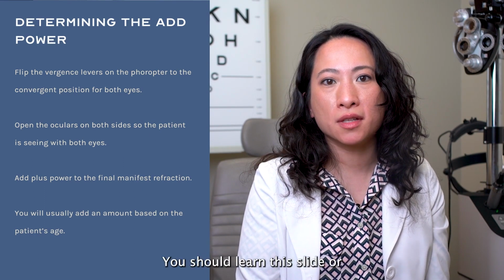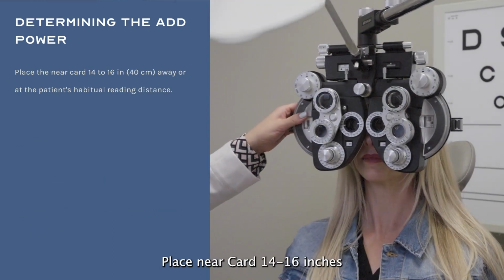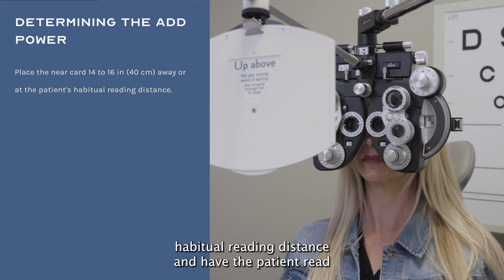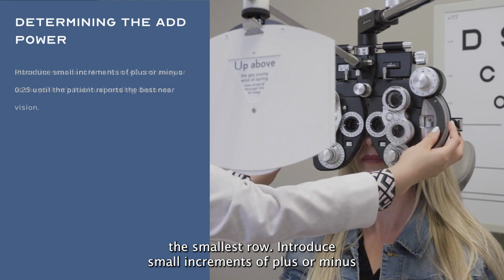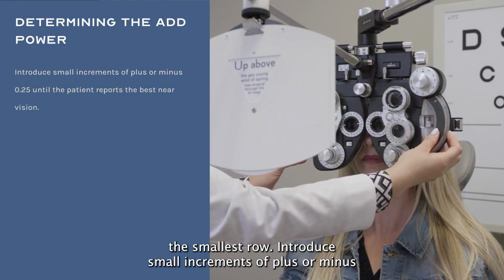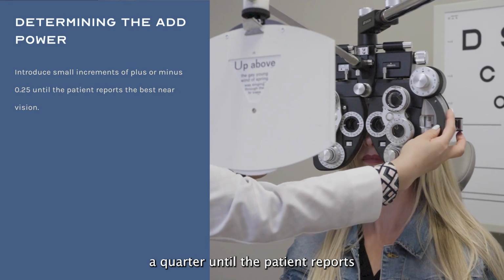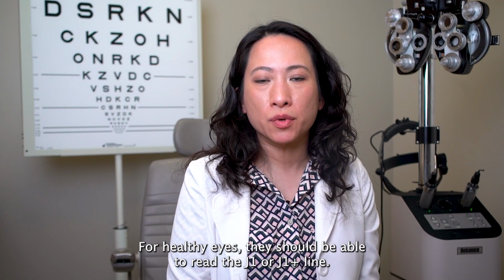You should learn this slide or keep this information somewhere handy. Place the near card 14 to 16 inches or 40 centimeters away, or at the patient's habitual reading distance, and have the patient read the smallest row. Introduce small increments of plus or minus a quarter until the patient reports best near vision. For healthy eyes, they should be able to read the J1 or J1 plus line.